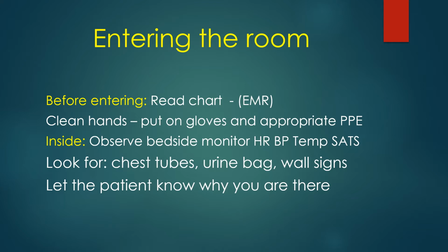And as you go into the room, this is where the view from the door is a very important concept. From the door, as you're walking toward the ventilator and the patient, you learn to do this very quickly. You want to look at the bedside monitor and see what the patient's heart rate, blood pressure, body temperature, and O2 sats are. All this information on that monitor is very important, and you want to make a mental note of what these things are, especially heart rate and blood pressure.